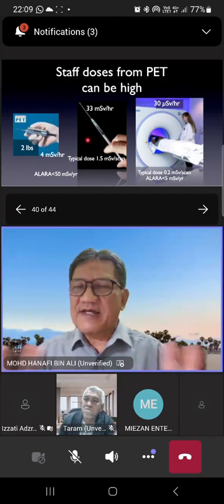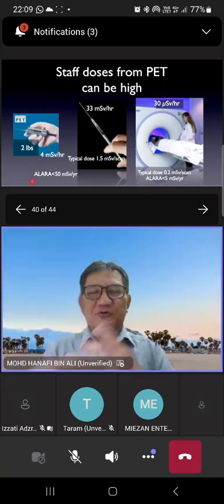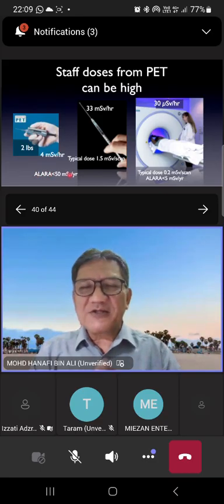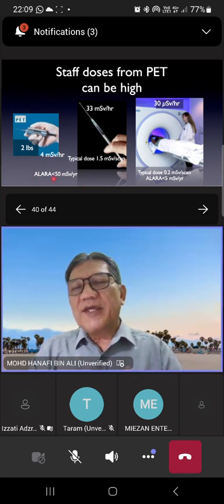Radiographers position the patient, set the machine, and sit outside, communicating through intercom. So only the patient is left there, and the radiation is totally for the patient. The staff stay outside unless we do extra examinations.